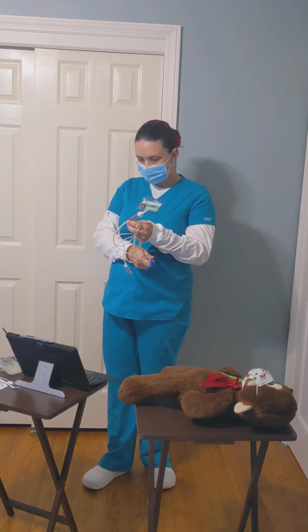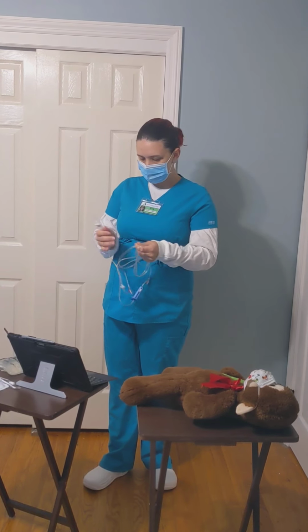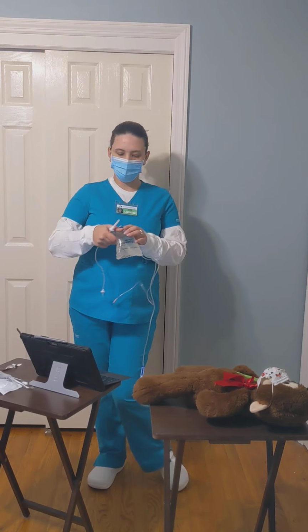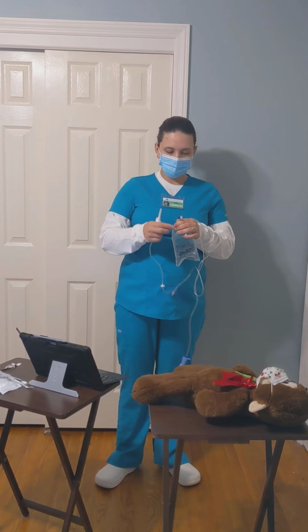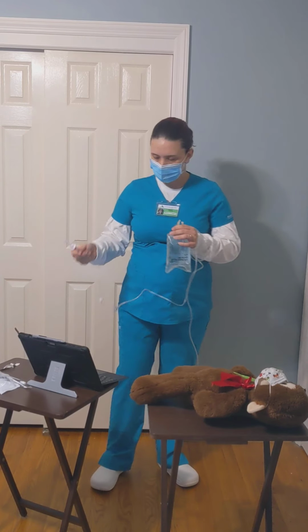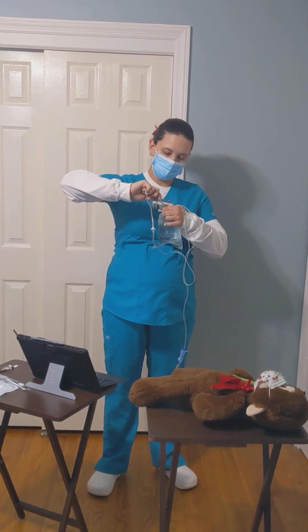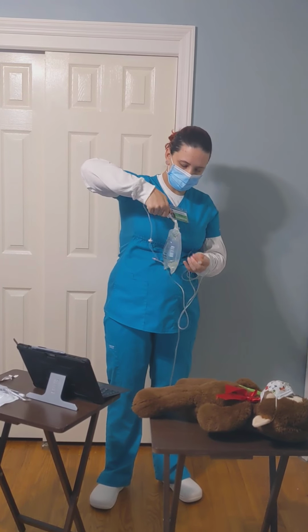Going to clamp the tubing. We're going to be sure not to contaminate either end of this after opening. And we're going to spike our medication bag.